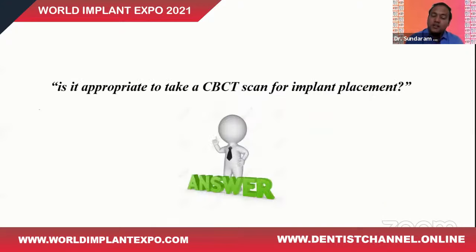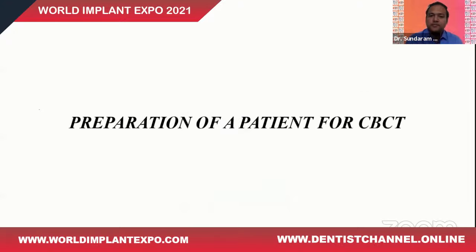So now we again come back to the question: is it appropriate to take a CBCT scan for implant placement? Well, I would say in my experience too, yes, it is appropriate to take a CBCT scan as far as implant planning is concerned. Now I'll take you through a series of slides wherein you will know how to prepare a patient for a CBCT.